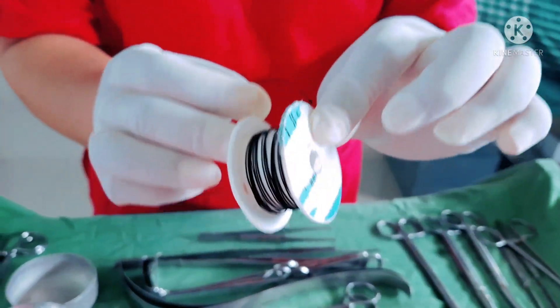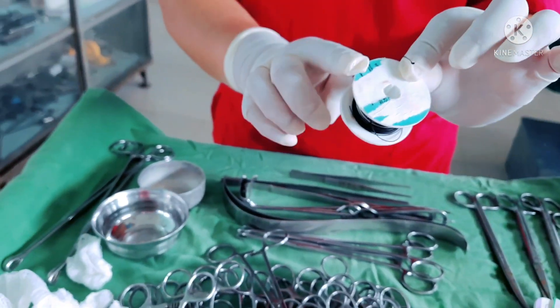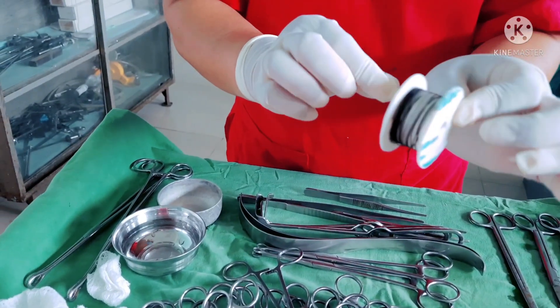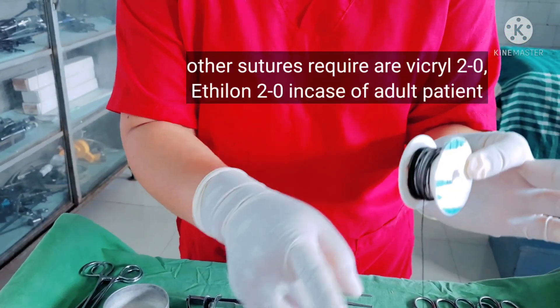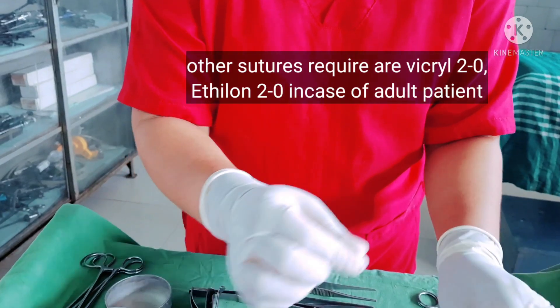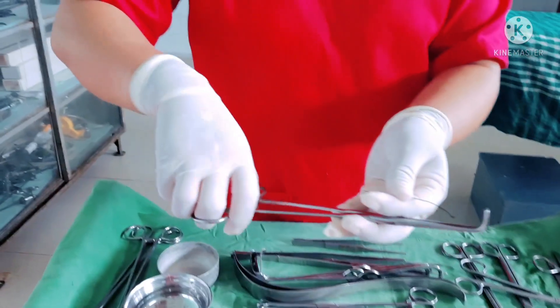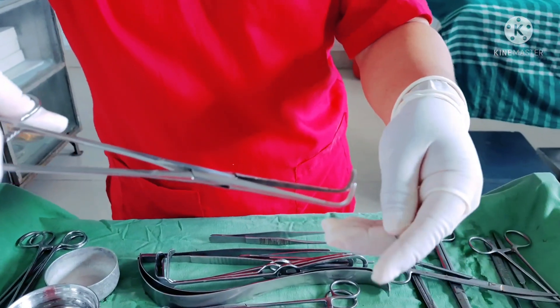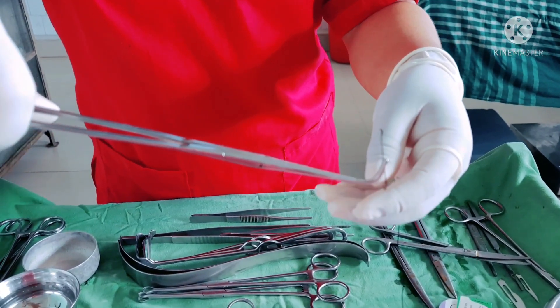This is known as a free reel — it doesn't have any needle at the end, so it is known as a free reel. Let me show you how to use a right angle forceps with this free reel or any other suture, allowing the doctor to grab the suture around any structure to ligate.